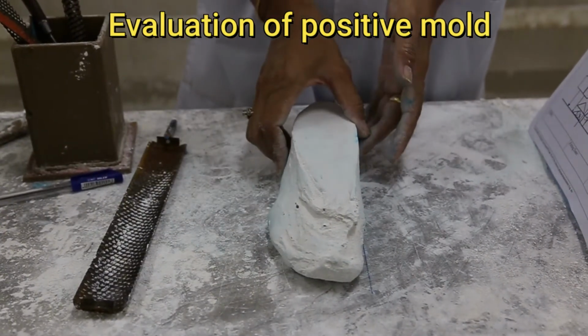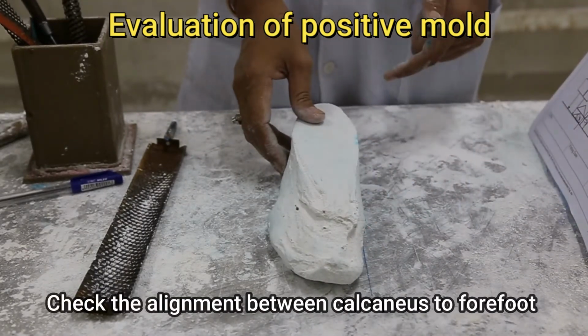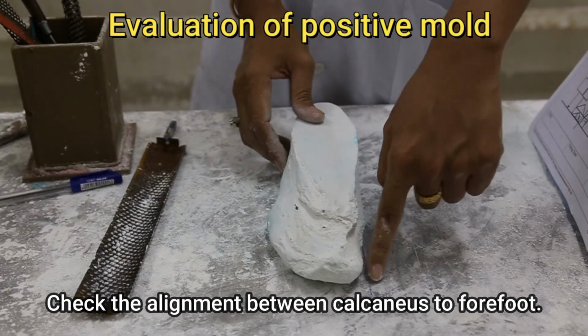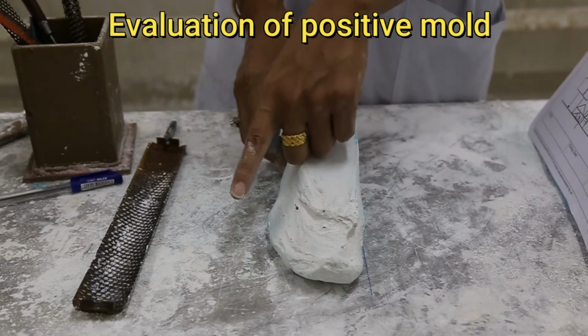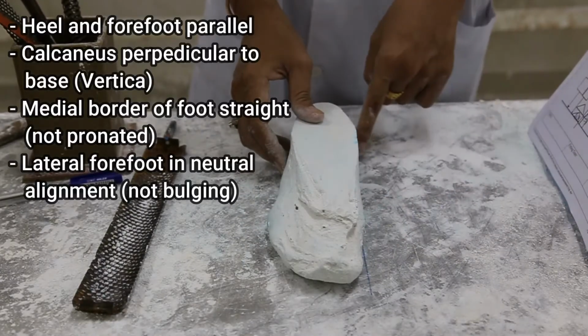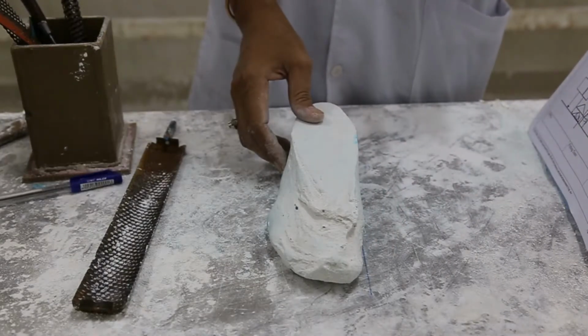So next step, we are going to check how is the hind foot and the forefoot, because sometimes when you cast from the clients, the forefoot might go to adduction, or too much abduction. So we need to check it, the hind foot and the forefoot must be parallel to each other and also must be parallel to the line of progression.